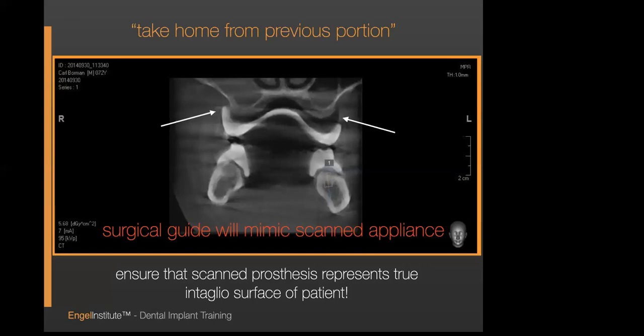Now, that being said, I just want to compartmentalize a couple things here. There's a lot of us that have technology. There's a lot of us that have the desire to be technological, and there's some in between. So I'm going to tell you that 80% of us are actually taking these 2 scans, or 3 scans in the case of upper and lower dentures, and we're sending it to 3D Diagnostics. Then we join a webinar with them, look at the procedure, look at the surgery, design the surgery, and then we're done. That's it. So we borrow them and their knowledge for the software, for the session. They're going to move things around, and then they're going to print my guide. 80% of us do that.